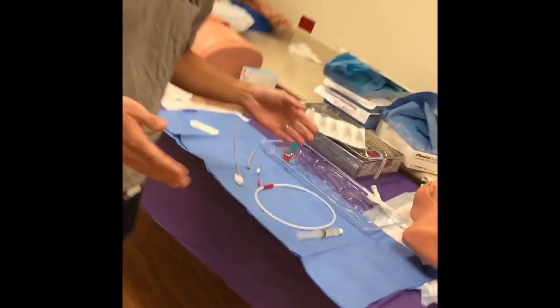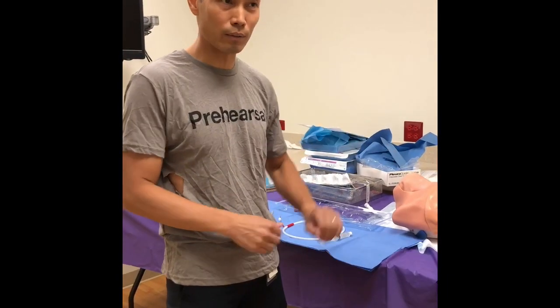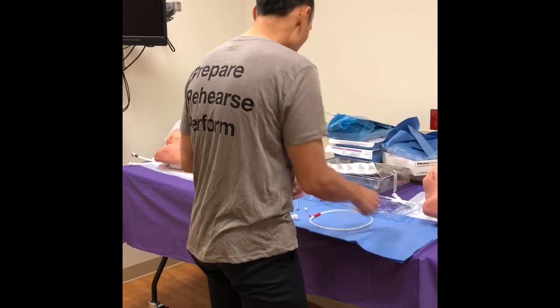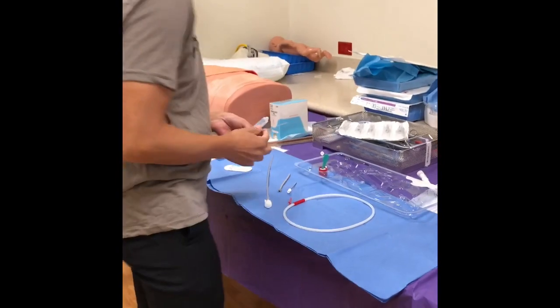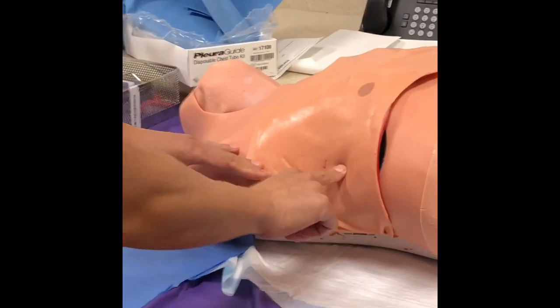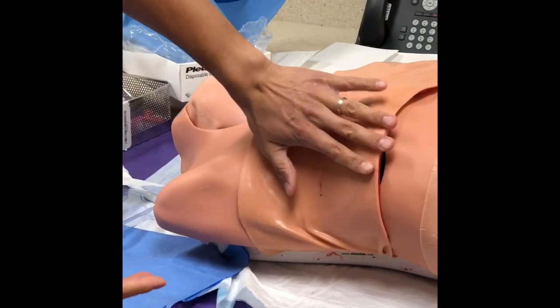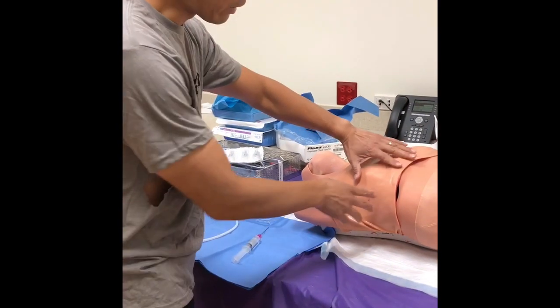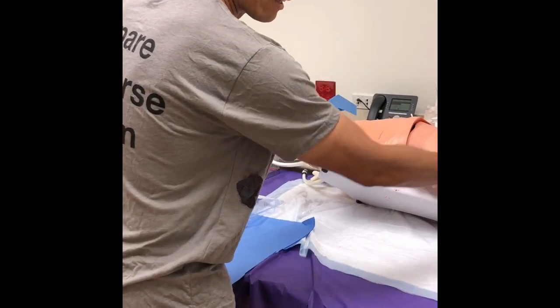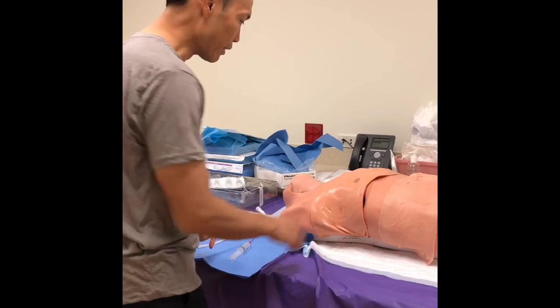Because this is a demo, I'm not draped — there's no sterile gown or drape — but make sure that you do that. Suspend disbelief. First, find your landmarks: nipple line, mid-axillary line is the easiest approach. If the person has a lot of chest tissue, have someone gently retract the skin to get close to the ribs, or lay the person on their side with the affected side up so tissue falls by gravity.